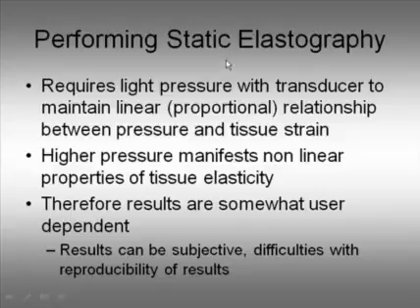We, again, just to review, to perform static elastography, you press with the transducer, and the person performing the ultrasound is the one who presses with the transducer. The pressure has to be very particular, not too hard, not too soft, because you want to be in the pressure range that maintains a linear relationship between the degree of pressure applied and the tissue strain.